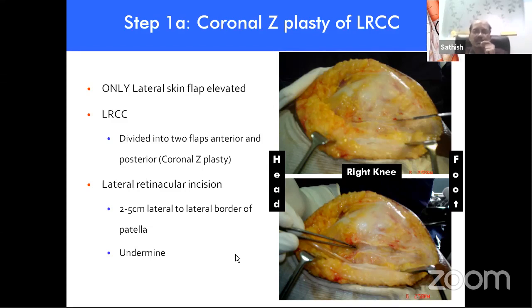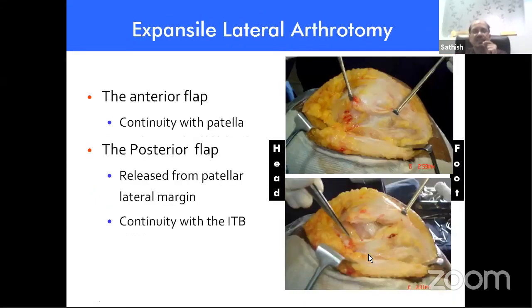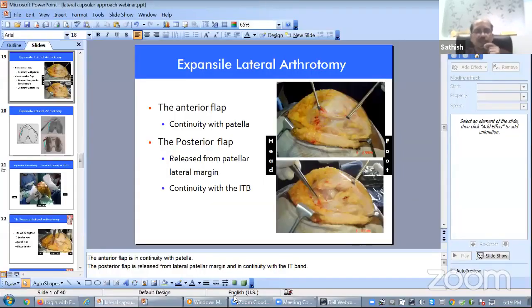Now, after elevating the skin and subcutaneous tissue, you consider the lateral retinaculum capsule complex as 2 layers. We are going to divide it into one anterior layer and one posterior layer. How do we do that? You mark an incision 2 to 5 centimeters lateral to the lateral border of the patella, and then start undermining dissection. The anterior flap should be in continuity with the patella, and the posterior flap should be released from the patellar lateral margin. So I will show a short video.